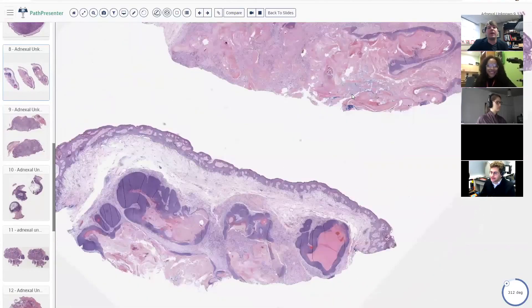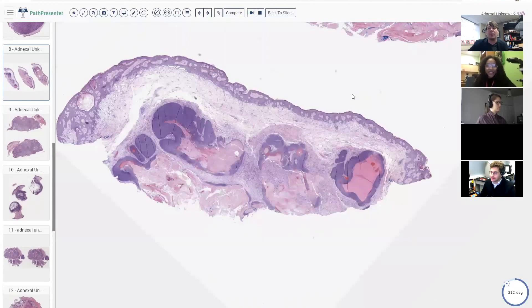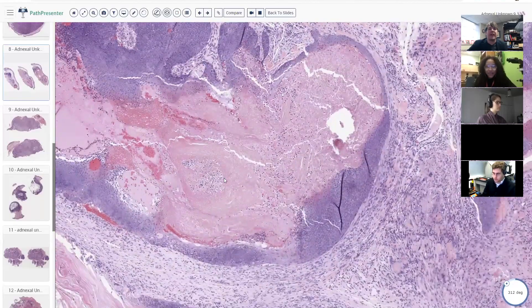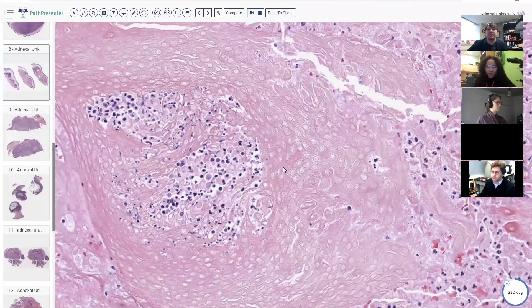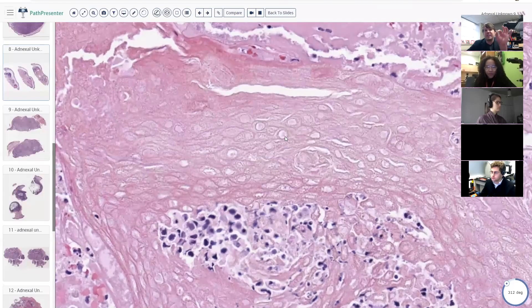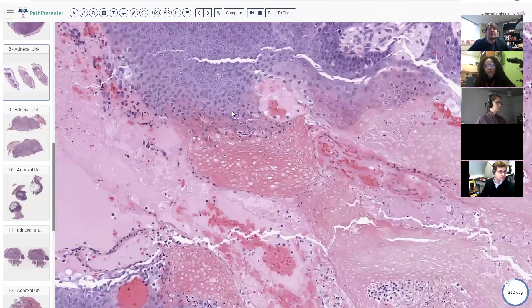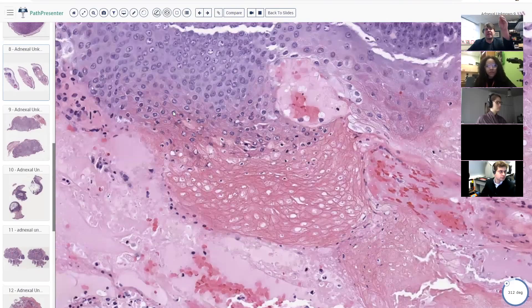What helps us identify this as a pilomatricoma from low power? Pilomatricomas have several components present in varying amounts. One is sheets of blue basaloid cells — that's what we're seeing right here. The other component is sheets of dead keratinized ghost cells or shadow cells. You can see where the nuclei used to be, like a sheet of keratinocytes that died suddenly, leaving behind their cytokeratin skeletons. Then there are intermediate cells where you can see the blue cells transitioning, nuclei becoming pyknotic, and dying away into ghost cells.